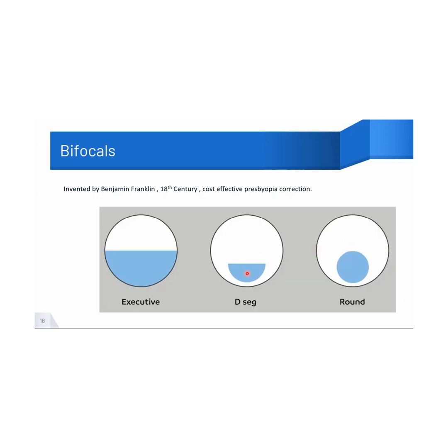But for DSEG, generally they will be much more comfortable with a shorter version of a progressive design. I hope this was clear. This is a very practical tip. Always remember this. You can always go back and do further reading on this. Just for the want of time, I'll move on. But it's a very simple slide.